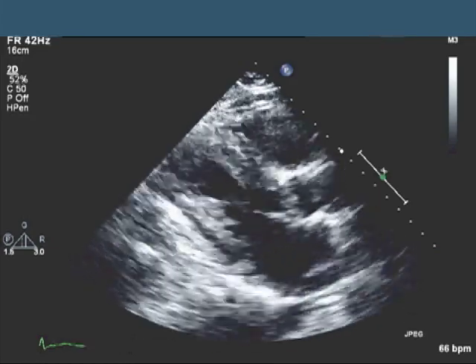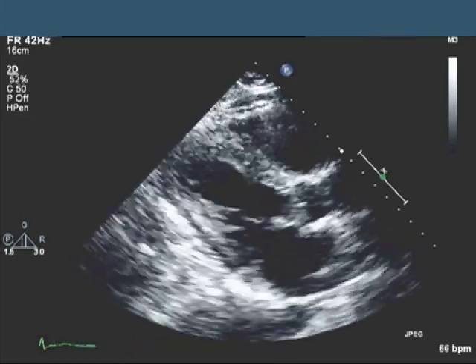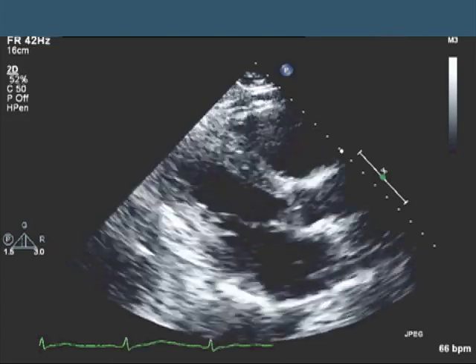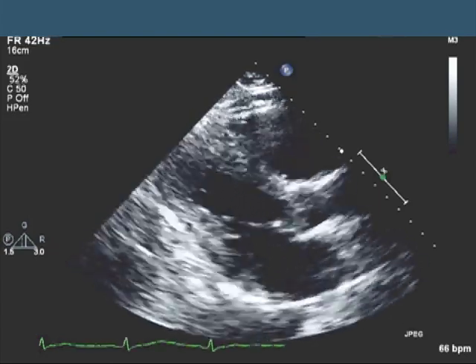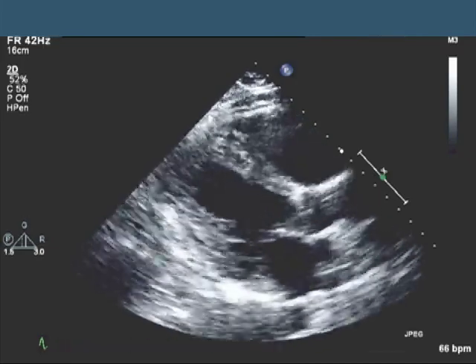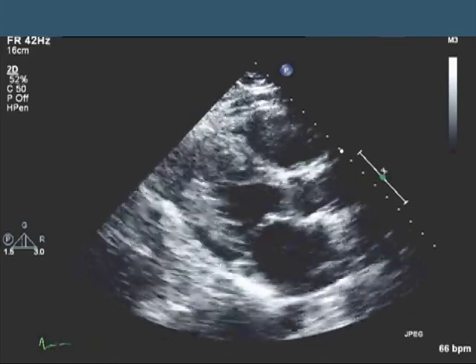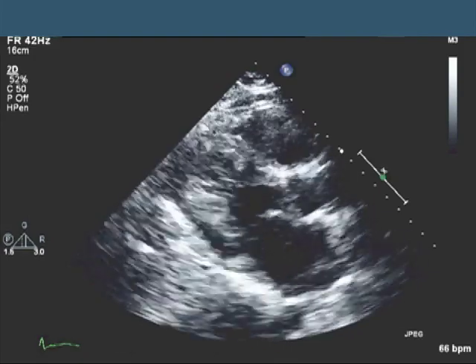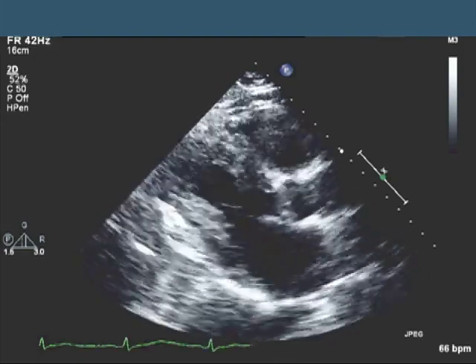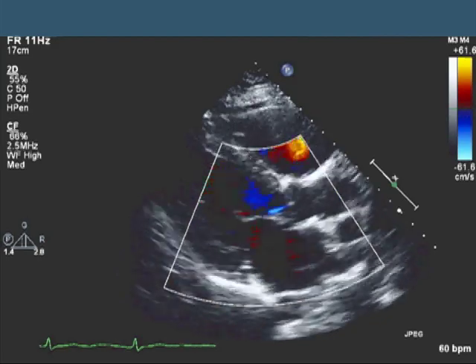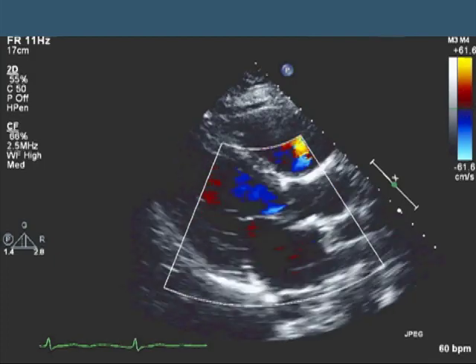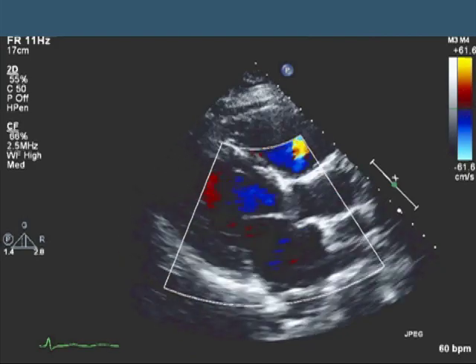So why is the pulmonary artery systolic pressure high? Here we see a parasternal long axis view. You can see that the aortic valve is a little thickened but opens normally. The left ventricle is dilated, and the right ventricle is dilated during diastole — in fact, you can't even see the entire RV. The mitral leaflets are a little thickened but open normally. When we put color on the same image, you can see trivial aortic regurgitation and no mitral regurgitation to speak of. If you look very closely in the sector, you'll see something else which I'll come back to later.